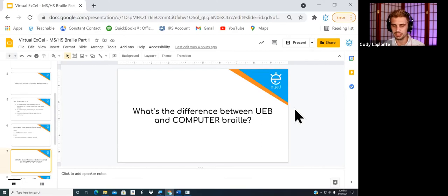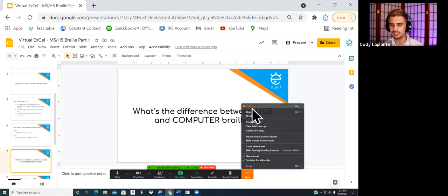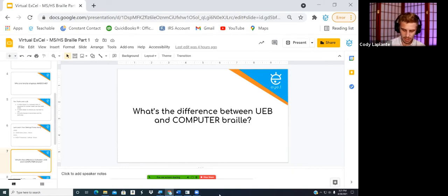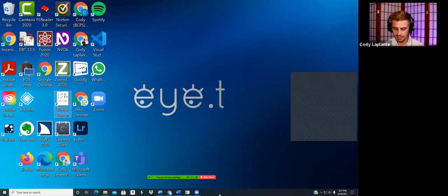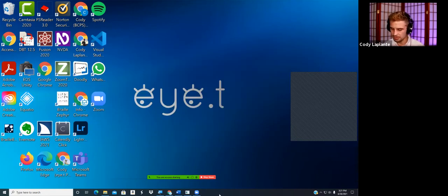I'm going to circle around to the chat to make sure that I've answered some questions or kept in touch with the people that are in the live session. But even if you're in the recorded session, what is the difference between Computer Braille and UEB? What is the difference between Computer Braille and UEB?